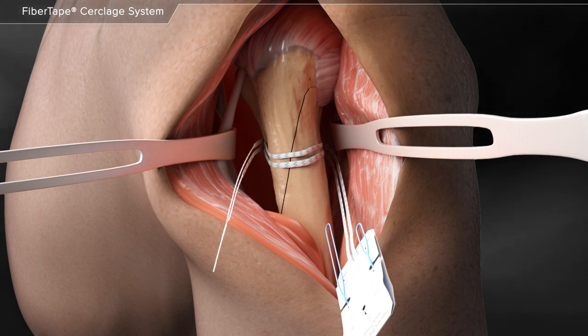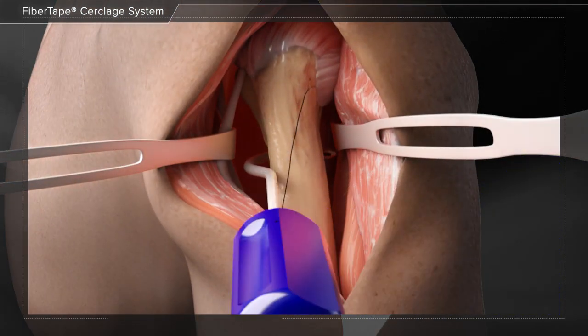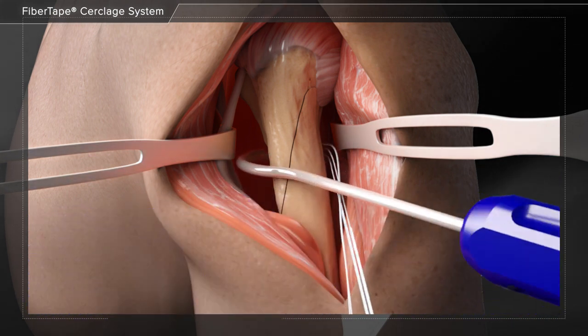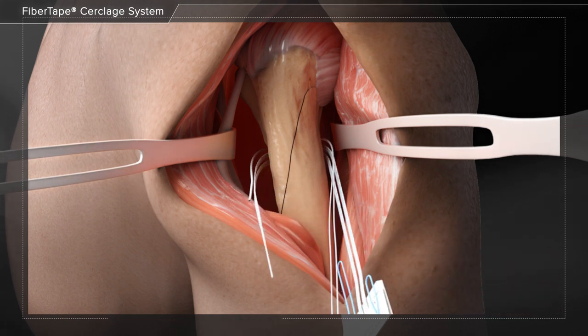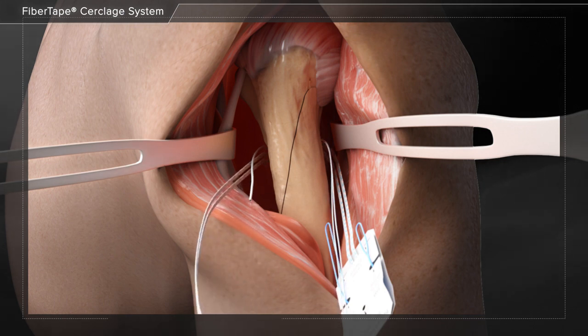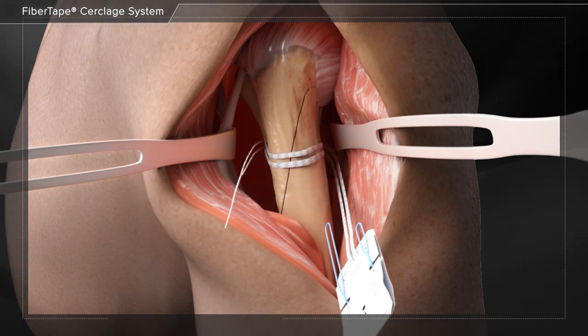If preferred, there is a passing hook that could also be used to facilitate the passing of the cerclage suture. The hook is placed around the bone. Then the FiberTape cerclage suture tail is loaded into the eyelet of the hook along with a FiberLink suture. The hook is pulled back around the bone and the sutures are unloaded from the eyelet. Next, the tail of the FiberTape suture is loaded into the FiberLink loop to complete the second pass around the bone.